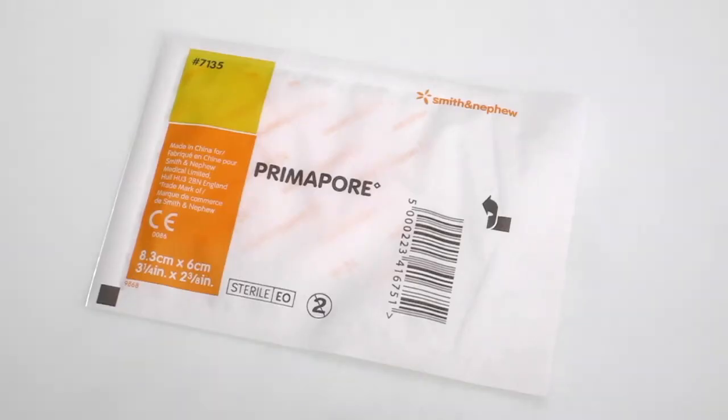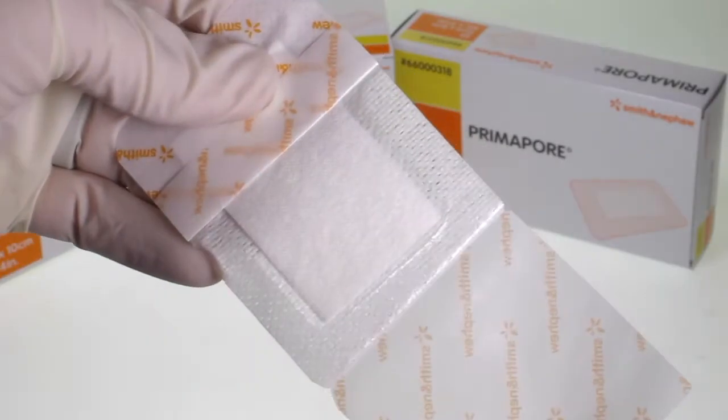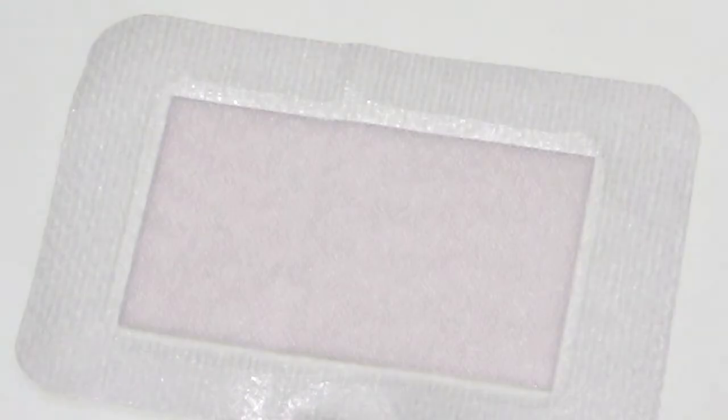Primapore is a soft conformable dressing that can be used to cover all wounds, particularly useful in curved areas of the body for surgical wounds and general cuts or lacerations. They consist of a melaline type pad and a water resistant low allergy hyperfix backing.